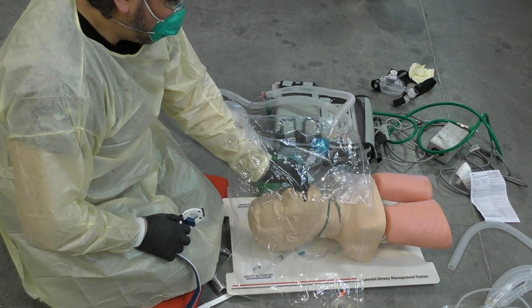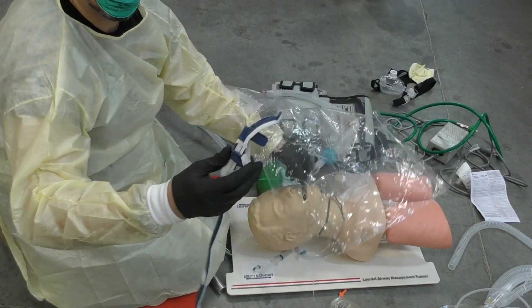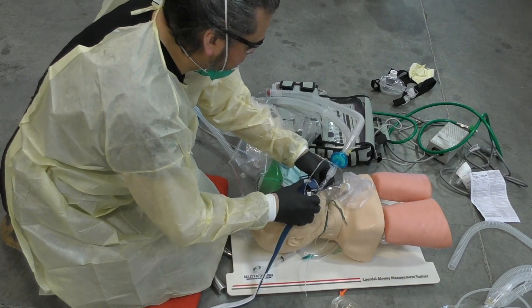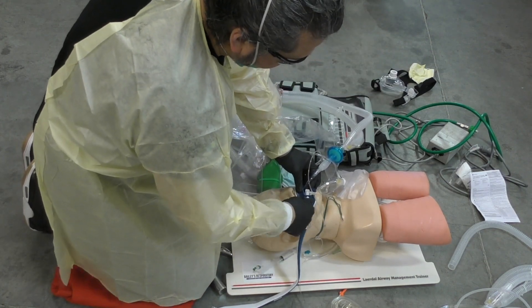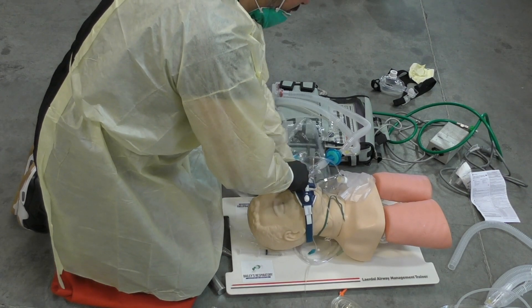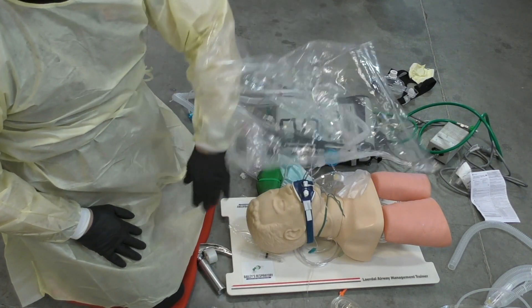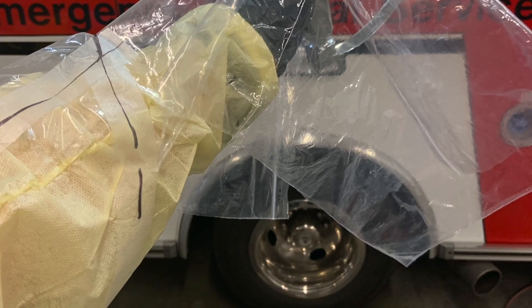Everything happened under that barrier — and I have it taped to my arm. I have my tube holder and I'm going to go ahead and secure the tube. We have a secure airway, the patient is on the ventilator, and we did it safely because we used the barrier on the left arm. Thank you.